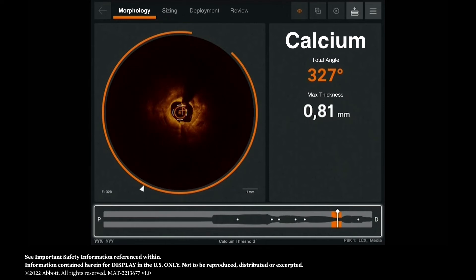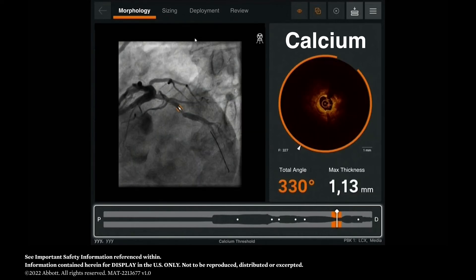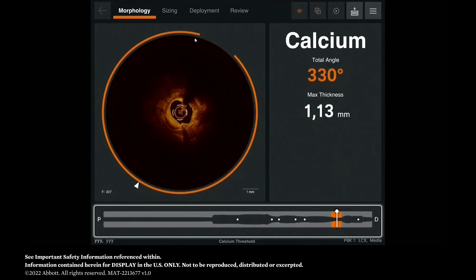I wanted to show you also how you can see the coregistration images to determine where this exact frame corresponds in angiography. You can see here, nicely shown, where this severe calcification is located in the angiogram.